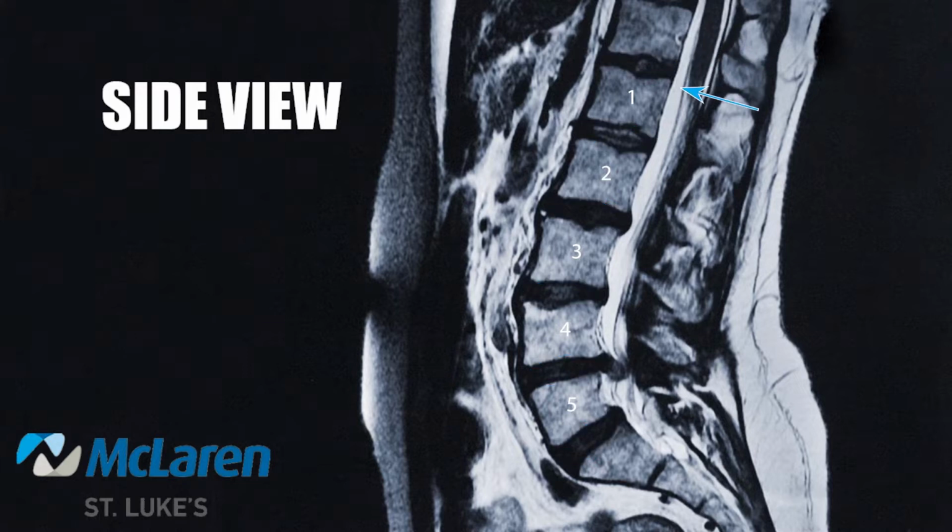In addition, you can see this white stuff here. That's spinal fluid in the spinal canal, and the little stripes that you see are the nerve rootlets that run within the spinal canal. So again, we're looking in from the side. This would be the front, this would be the back, and this is the tailbone.